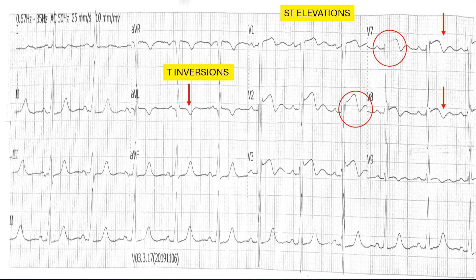Now have a look at the Q waves as well. These are pathological Q waves which are present very clearly in lead AVL; however, we cannot see any other leads showing these Q waves. We need to be careful when evaluating such Q waves and determine whether these are pathological or non-pathological, especially in relation to cardiac ischemic events.